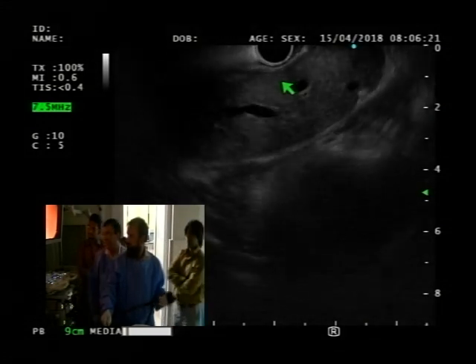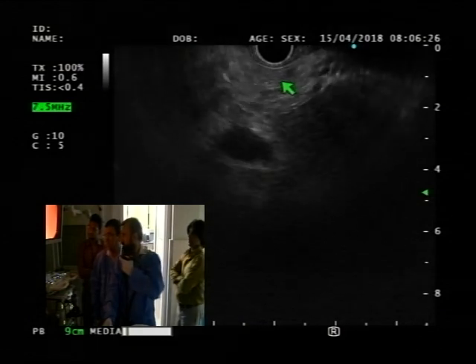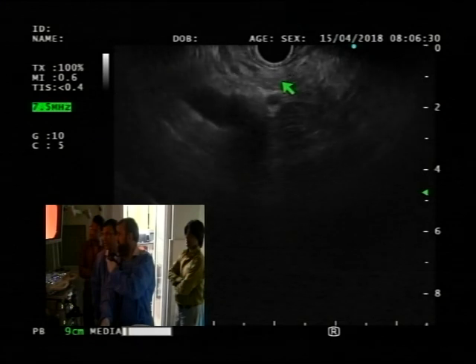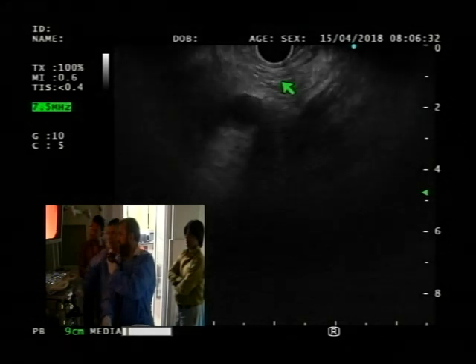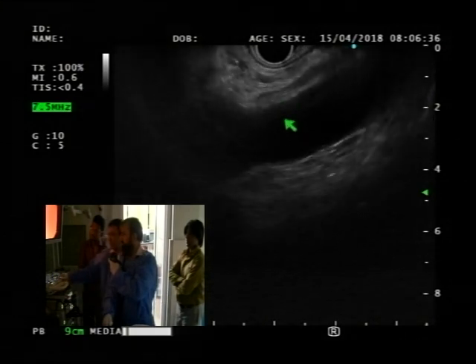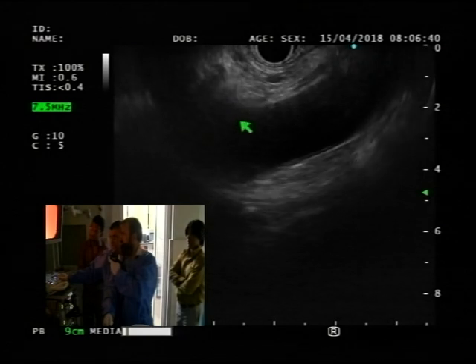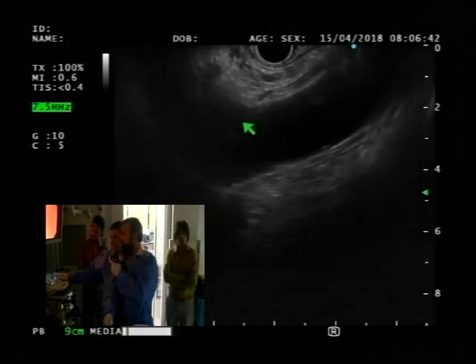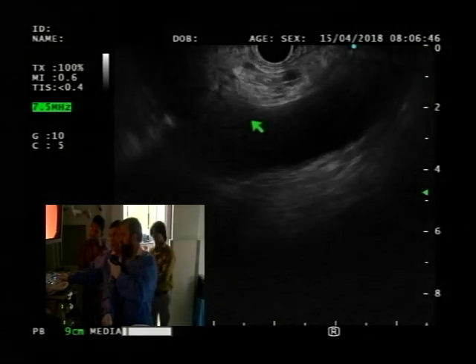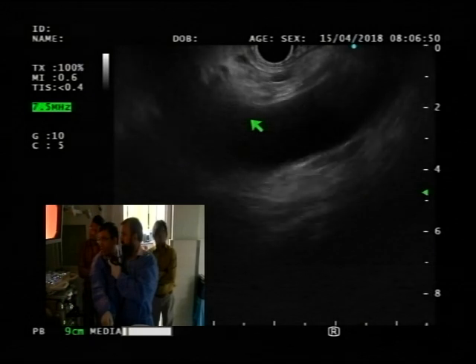From here rotate to the right, keep rotating, keep rotating. So you didn't see it, okay? So right there, good, excellent, okay? Where is the celiac? Rotate it, celiac is right here, okay? Bring the celiac into view again. Good, excellent. So now, no, bring it into view again. Okay, let's follow that now.